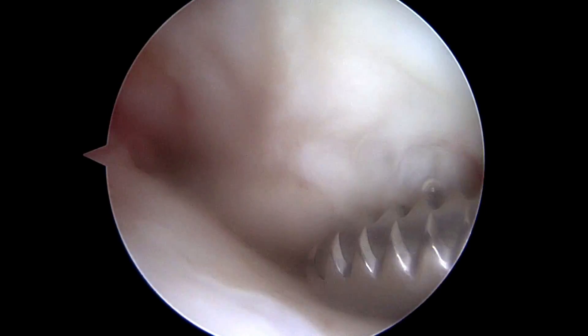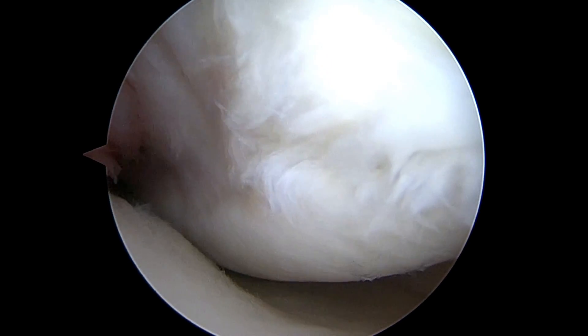Hi, this is Dr. Buford. We're just getting started on the right knee. We've already harvested the bone marrow that we wanted to get to create the stem cell injection.